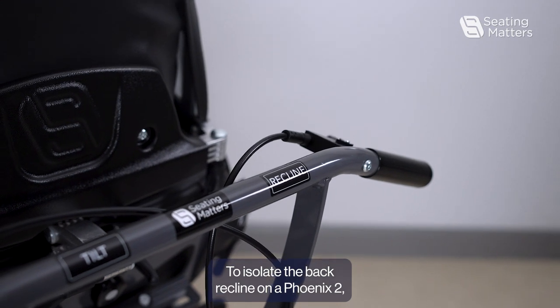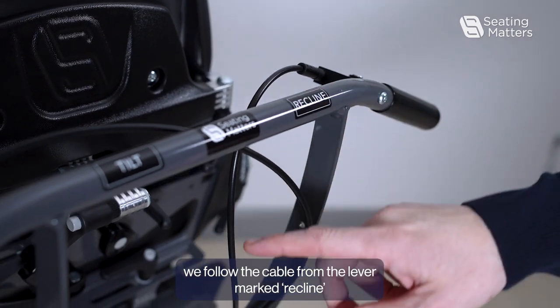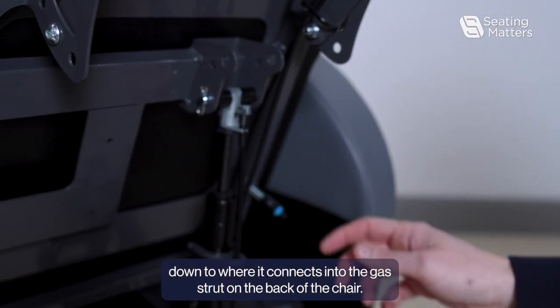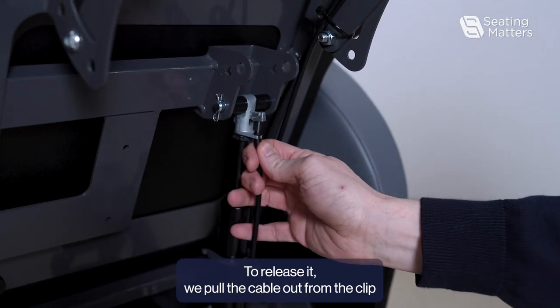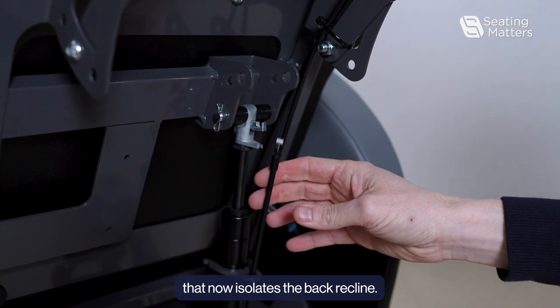To isolate the back recline on a Phoenix 2, we follow the cable from the lever marked recline down to where it connects into the gas strut on the back of the chair. To release it, we pull the cable out from the clip. That now isolates the back recline.